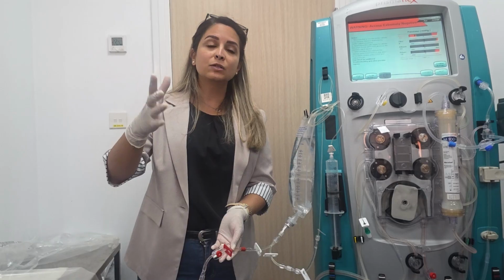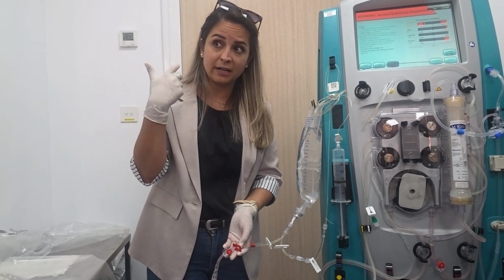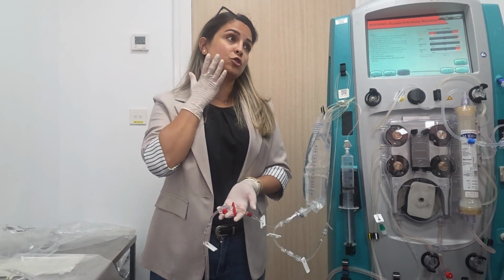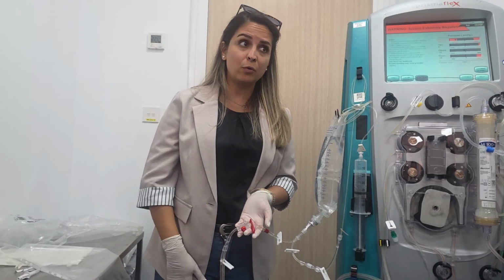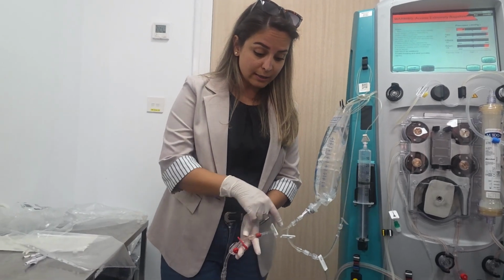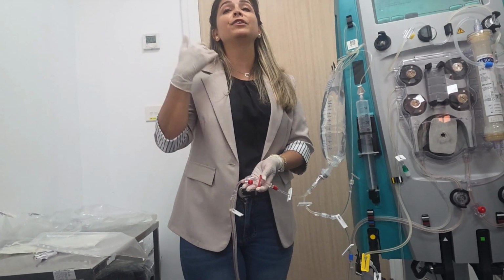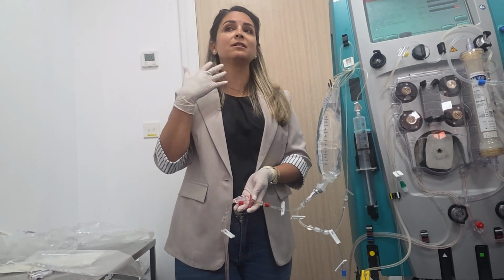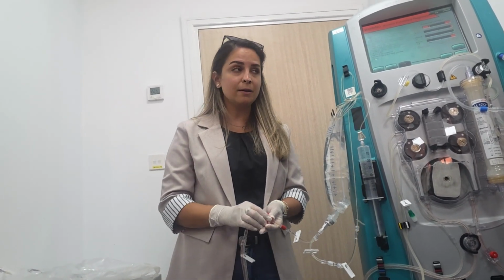That's why I might flush the catheter itself to see how the flow is. Check the position of the patient, position of the catheter, especially when you have a femoral one. Check that there is no kinking, or maybe the blood flow you put is very high, so the catheter is not tolerating. So I need to reduce the flow rate a little bit.